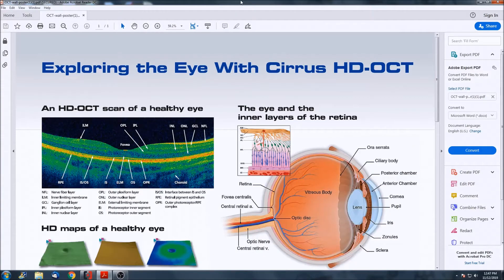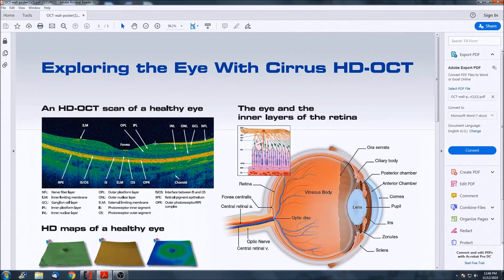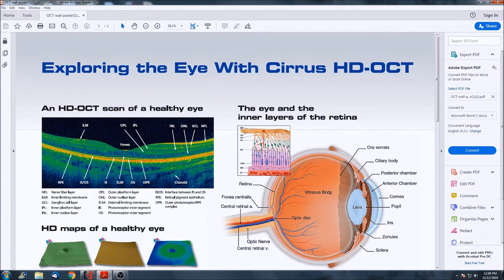An OCT is a laser scan of the back of the eye. Think of it like an ultrasound, except instead of being done with sound, it's being done with light. What we want to see is a nice dip in the macula where you get all of your detailed vision. The center of the macula is called the fovea. You'll see the fovea has a nice little dip, and we want to make sure we've got that nice consistent red and yellow line. You can see on our eye where the fovea and macula is.